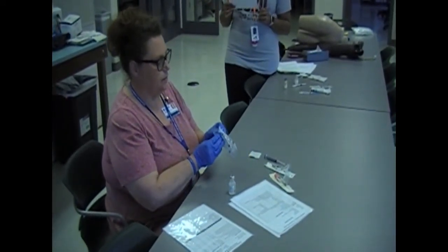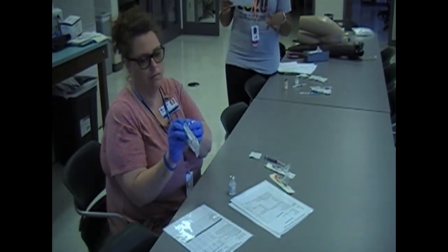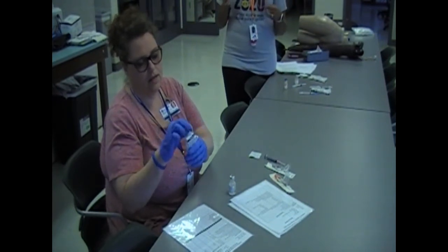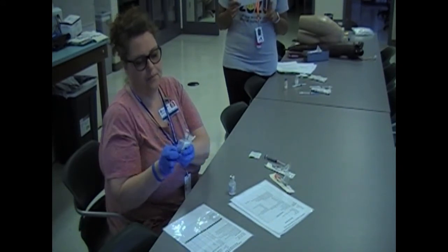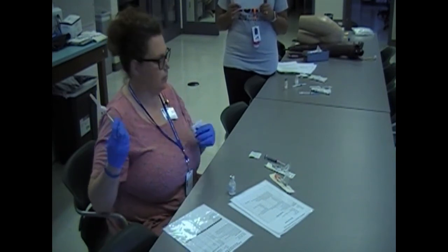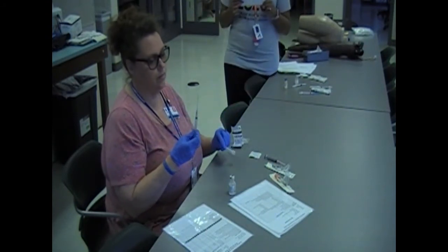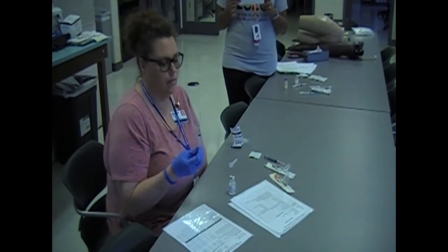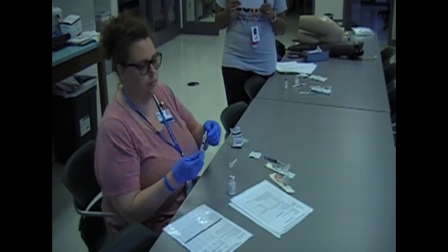You're going to maintain your sterility as you open your needles and syringes from the package. It is helpful to fold the wrapper back like a banana peel as you attach the syringe to the needle. Remember not to reach over your sterile fields and cross-contaminate. Carefully remove the cap from the needle with the cap facing upward or sideways to maintain that sterility. Be careful not to contaminate the needle or the cap. Insert the needle into the center of the vial.